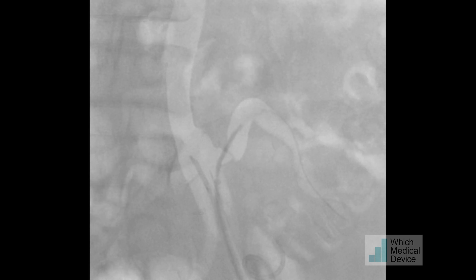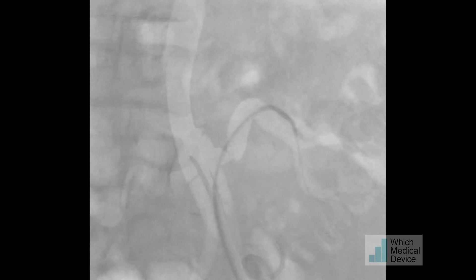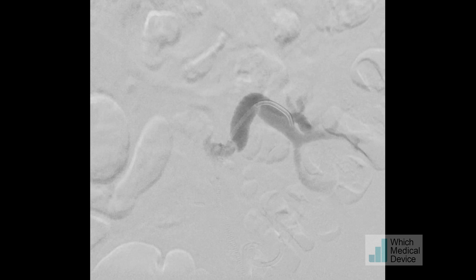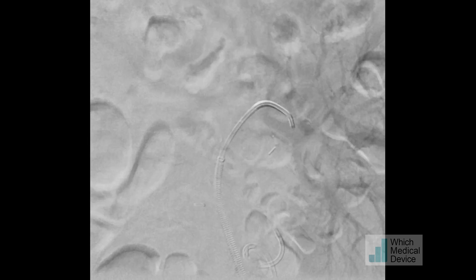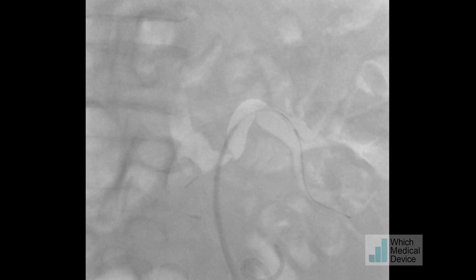The catheter went through relatively easily, and I'm taking it around the corner. We're now changing for an 018 wire. Angiography through the sheath confirms my position and shows I haven't completely dissected the artery in the process. This is an 018 SV5 wire, which will give quite a lot of support for angioplasty and also to place a balloon-expanded stent.